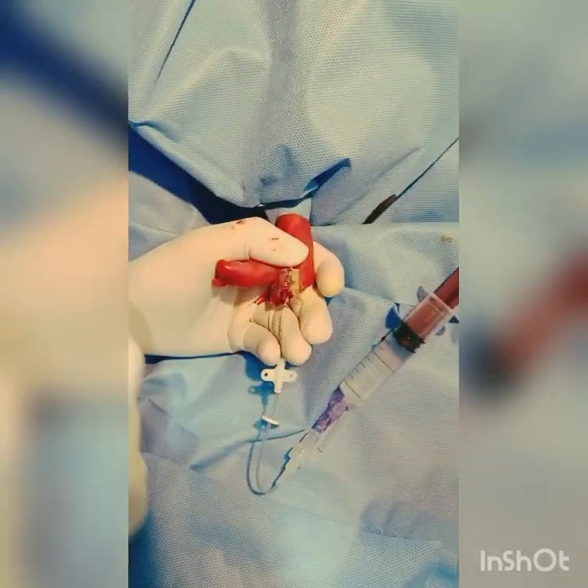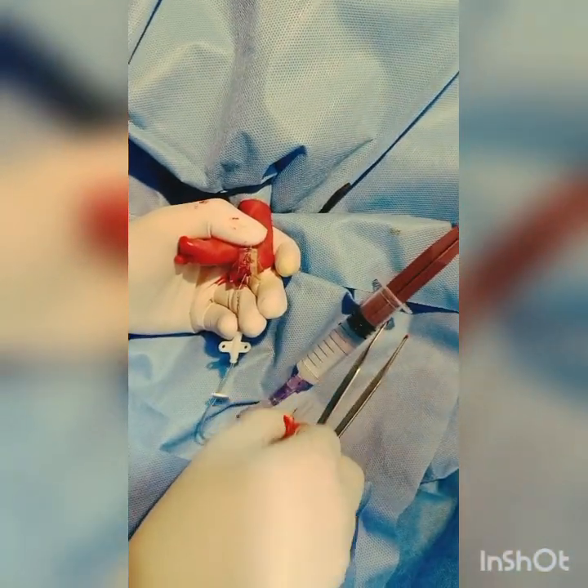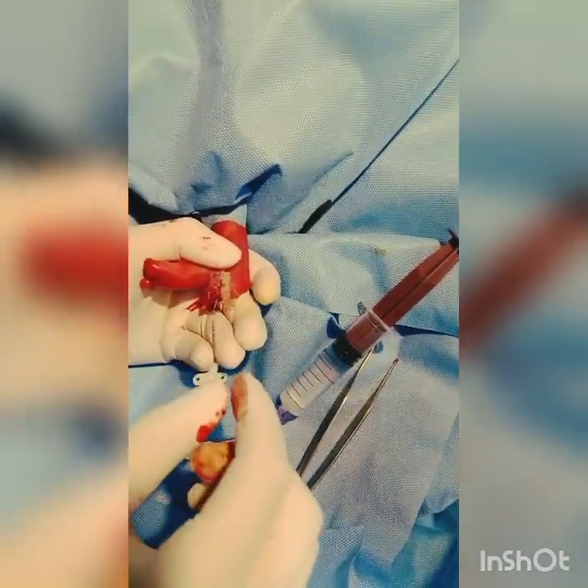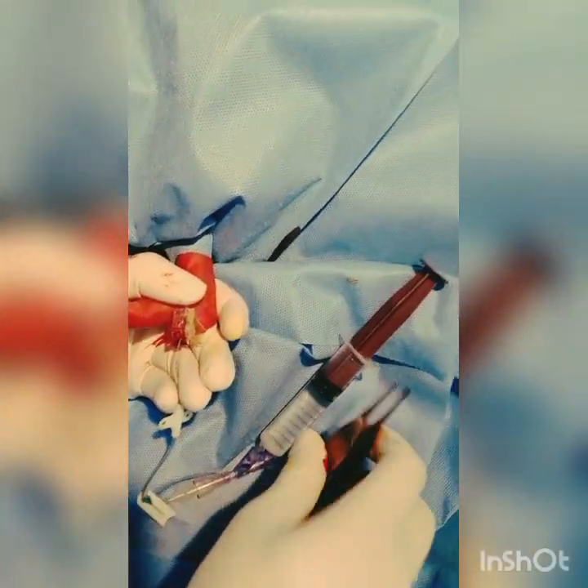Maintain hemostasis as well. And flush once. Let's use the ultrasound machine to see where the tip of the line is.